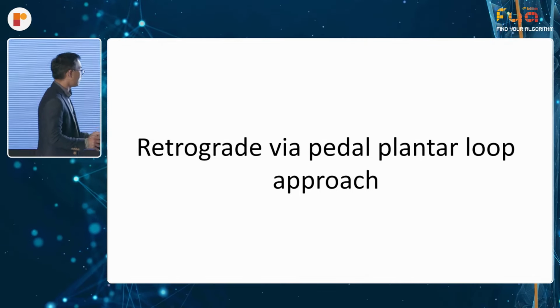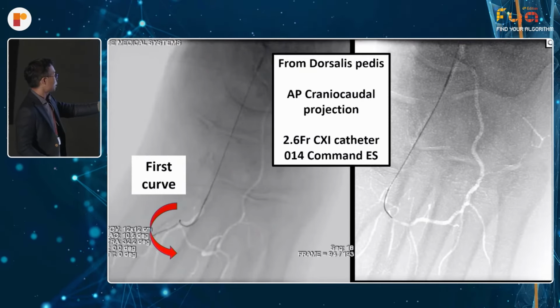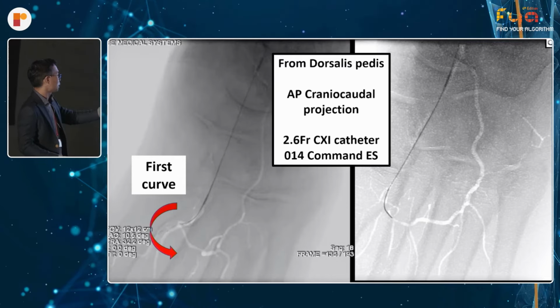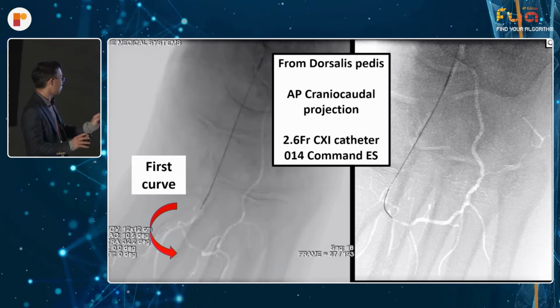So retrograde via pedal plantar loop, that's a very important approach as well. It has to be in the armamentarium of all. For us, when we approach it from the dorsalis pedis, we always try and do it in the AP craniocaudal projection. We use a 2.6 French CXI catheter, 014 Command. And there are two techniques. This is a knuckle technique, but just be really careful not to dissect.